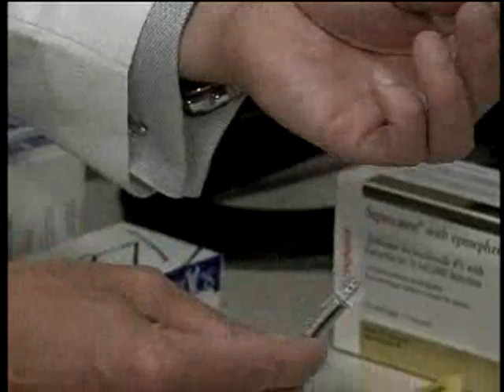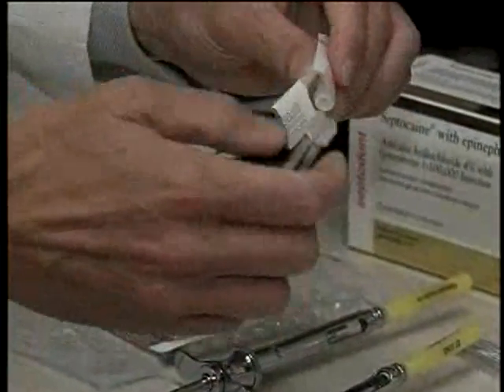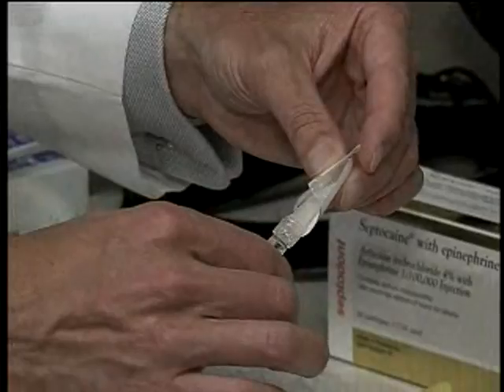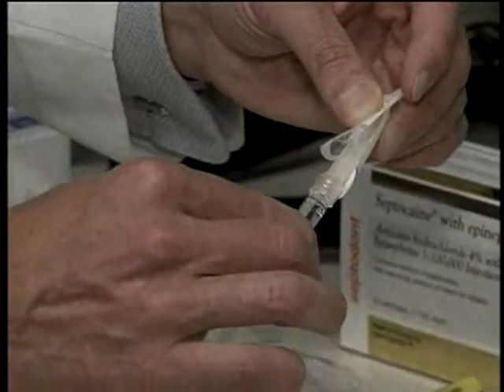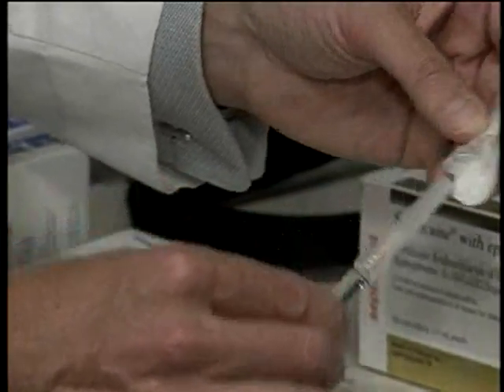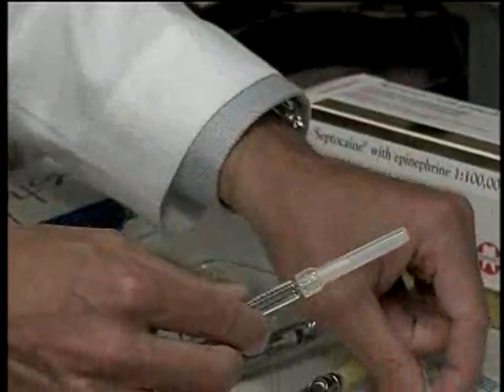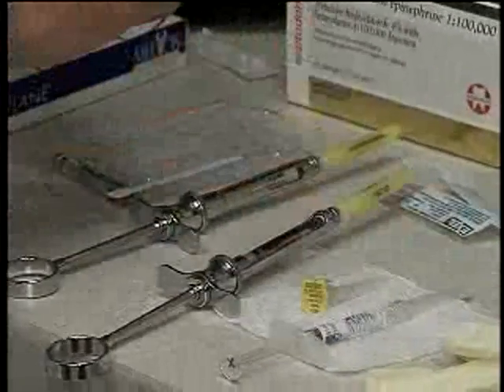So I remove the stopper. I take off my 30 gauge needle, and it's very important how I do this. I just twist this onto the end without actually touching this hub until it's tight. You don't want to over tighten it because you'll strip it, so just tight, and now that's ready to go. Once again, if you manipulate this too much, it'll loosen, and then it becomes at risk for popping off during the treatment, and that, once again, that's not fun.